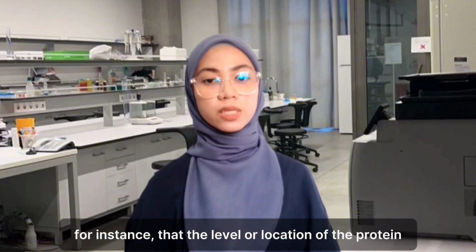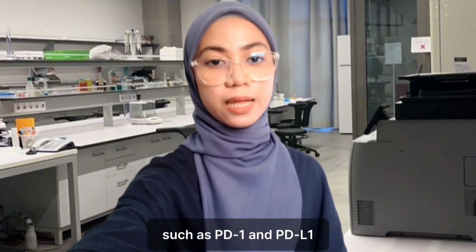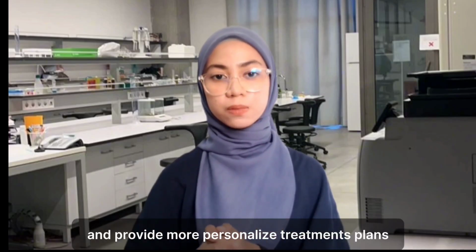For instance, knowing the level or location of proteins such as PD-1 and PD-L1 can indicate whether patients may respond to immunotherapy, hence allowing clinicians to predict how a patient may respond to particular therapies and provide more personalized treatment plans.